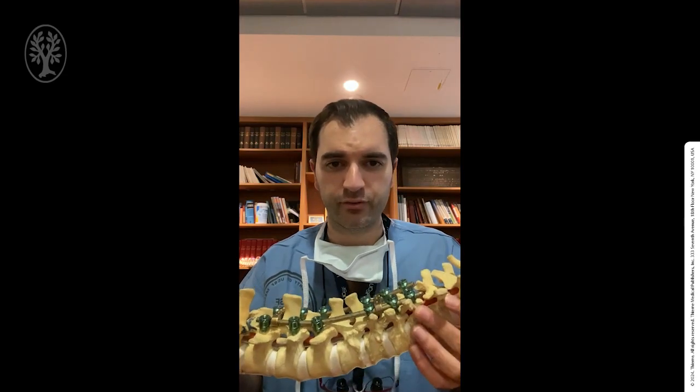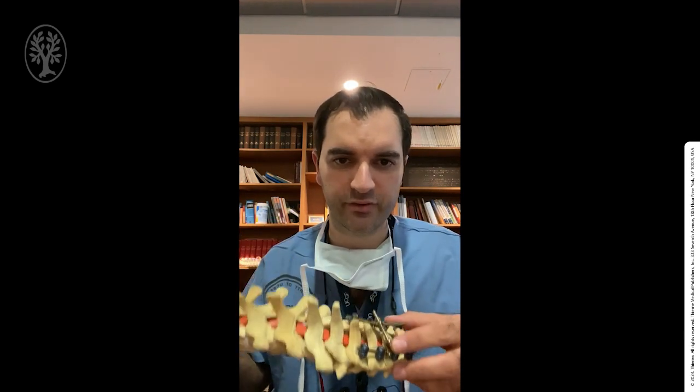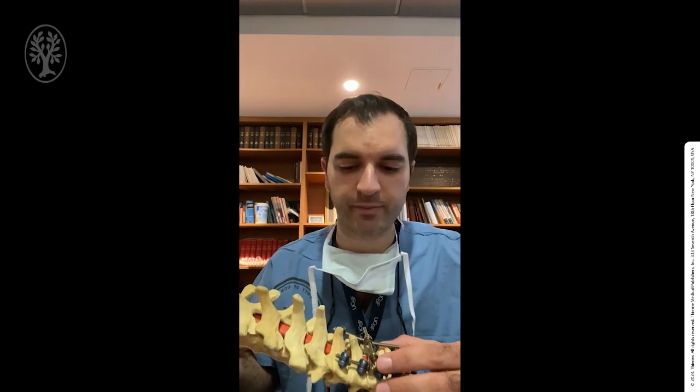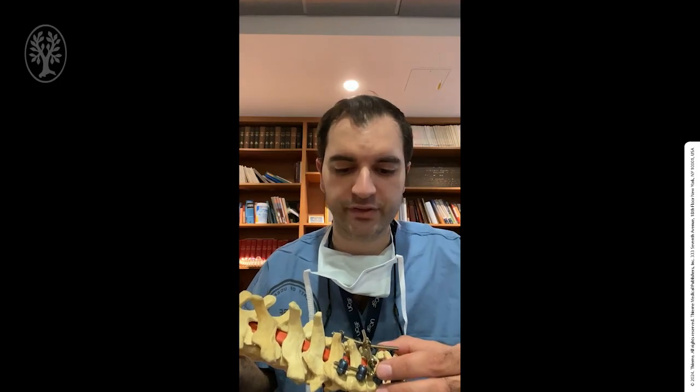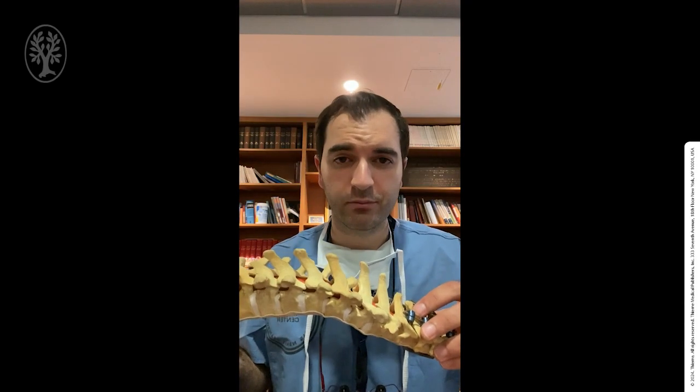There are other anchors we can use, and even if we use screws, we can place them in different locations and use them in a different manner. In this case, we have the pedicle screws. If we go to the cervical spine, we can use lateral mass screws. Oftentimes the pedicles in the cervical spine are smaller, therefore it's safer to place them in the lateral masses. We can also place them in the lamina in certain cases. Even further, we can place them into the vertebrae.